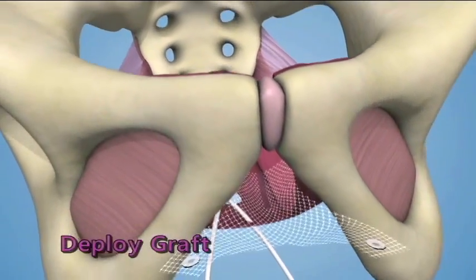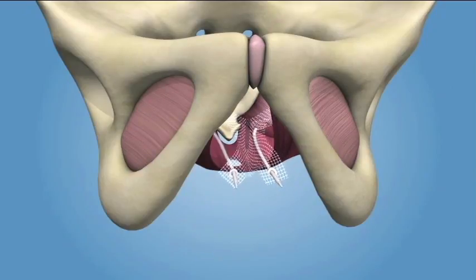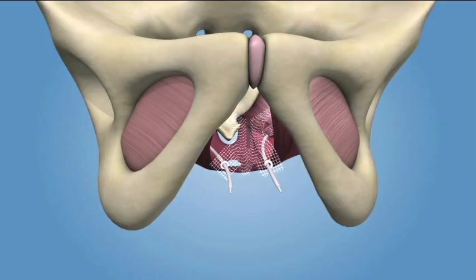Deploying the Graft. To deploy the graft, locate one of the loose eyelets on the graft body and slide the apical fixation arm anchored on the same side through the center of the eyelet. From the top side of the graft, pull the fixation arm through the eyelet and repeat on the contralateral side. Feed the previously placed sutures through the graft at the proximal tail of the graft.